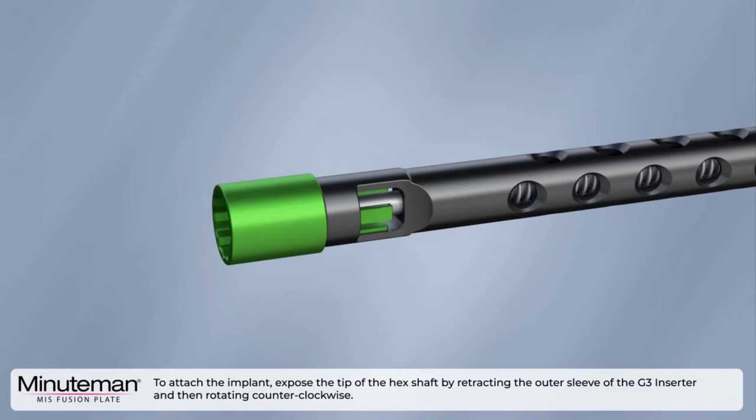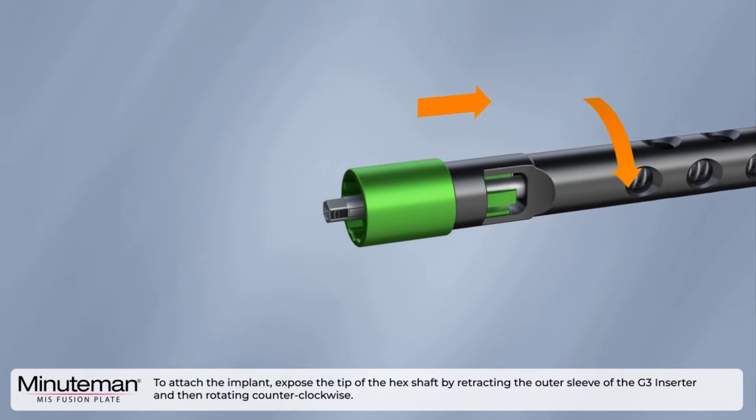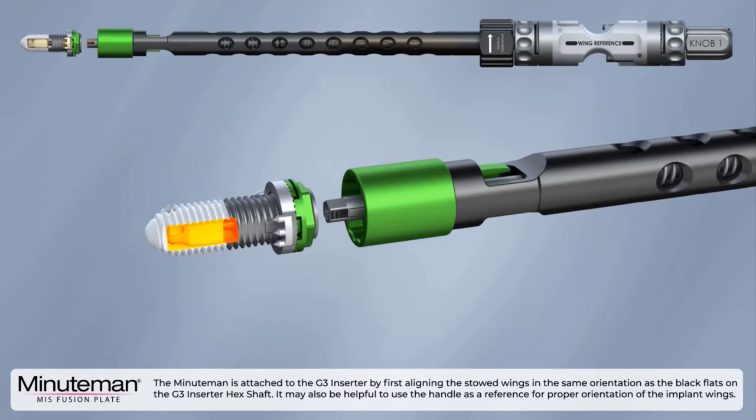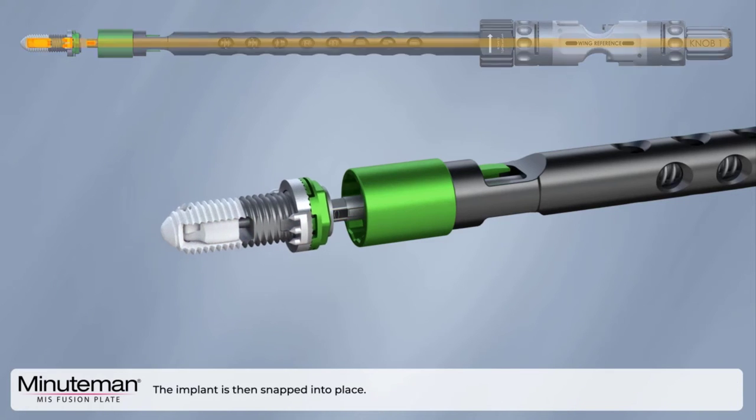To attach the implant, expose the tip of the hex shaft by retracting the outer sleeve of the G3 inserter and then rotating counterclockwise. The Minuteman is attached to the G3 inserter by first aligning the stowed wings in the same orientation as the black flats on the G3 inserter hex shaft. It may also be helpful to use the handle as a reference for proper orientation of the implant wings. The implant is then snapped into place.